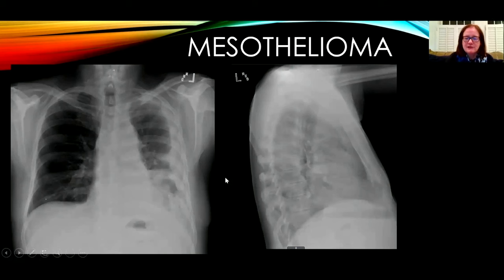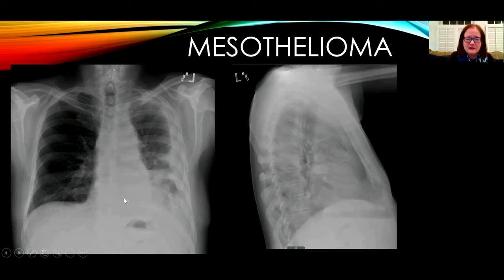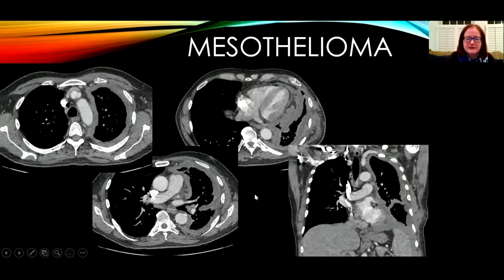This patient with progressive shortness of breath over a couple of years had worked in the building industry and was exposed to asbestos. The left hemithorax is reduced in volume, which is characteristic of mesothelioma. There is also nodular pleural thickening extending over the medial aspect as well as laterally. CT shows nodular pleural thickening extending over the mediastinal surface, into the pleural fissures, and there is also lymph node enlargement in the mediastinum. On the coronal view there is a decrease in the size of the hemithorax.